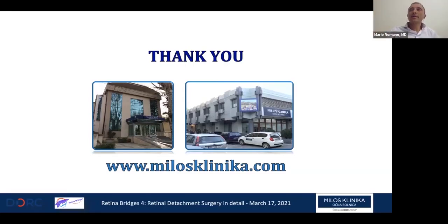Another thing, in the UK, mostly, because I have been there for a fellowship, they don't like to combine phaco with vitrectomy, okay? In other countries, they like more to combine both together. I'm doing a lot of combined surgery, but when we combine the surgery, doing the phaco and putting silicone oil in, sometimes you have adhesion because of the inflammation between iris, lens, intraocular lens, zonula, and hyaloid. So sometimes we have a matter of malignant glaucoma, okay? So do you think that in case of using silicone oil, we can do the phaco when we remove the silicone oil? What do you think?